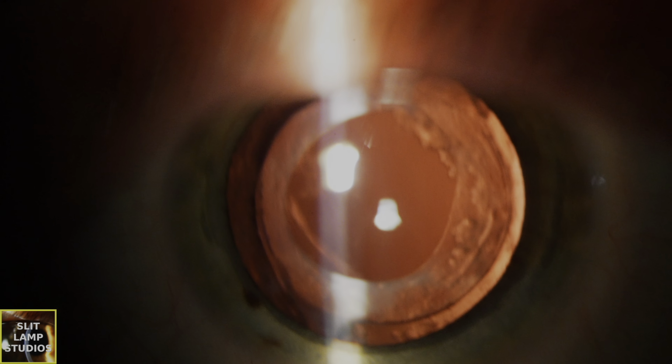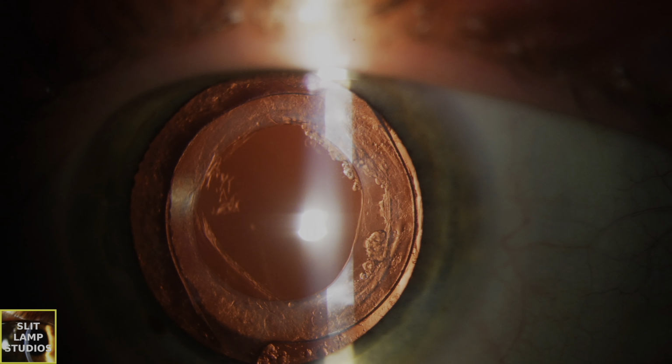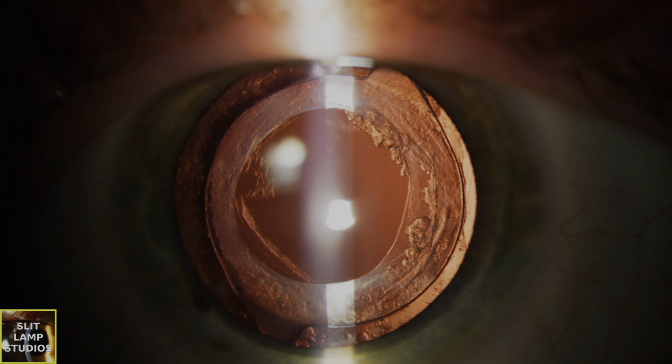So let's have a look at the fundus and see what's going on. And bear in mind that one of the big problems with Stickler's syndrome is that this is a genetic connective tissue disorder which is associated with abnormal vitreous, early onset retinal detachment, cataracts and high myopia, which explains why this patient's had cataract surgery in this eye. And so regular ophthalmic examinations and dilated fundal examinations are important because patients can develop retinal tears. You want to safety net them very closely.